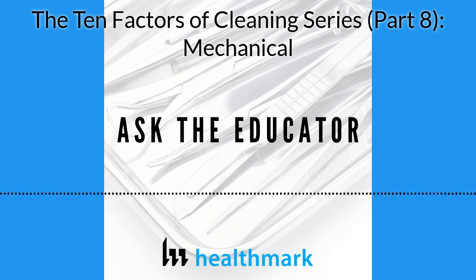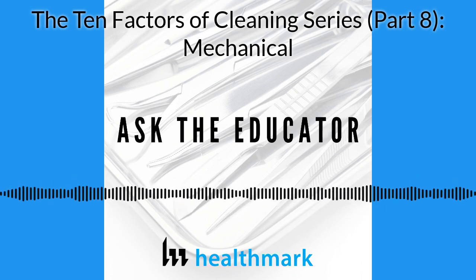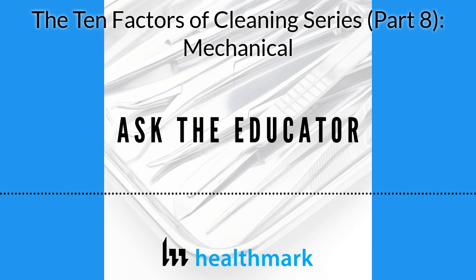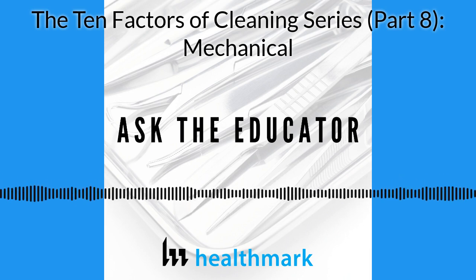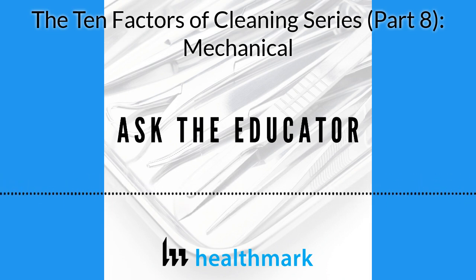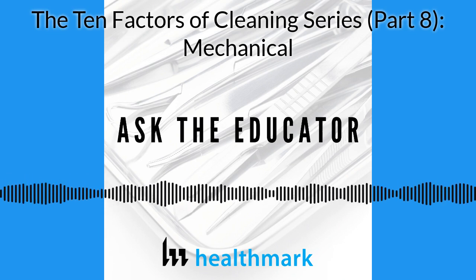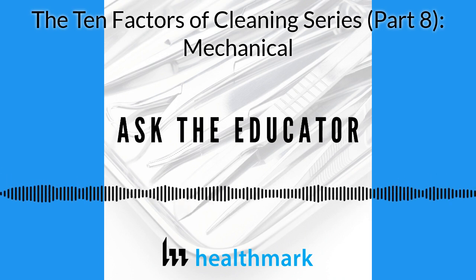So what is the mechanical part? It's the impingement. It's the power of the water, and how it comes through the spray arms. Everything comes through the spray arms: the rinse, the pure water rinse, your detergent. So it's that power of the water taking over the physical action of brushing and cleaning those devices.